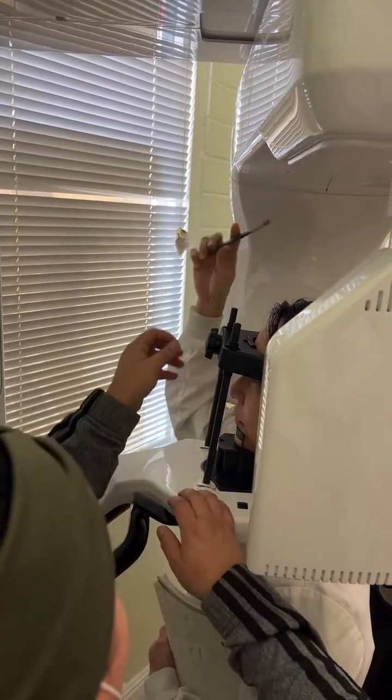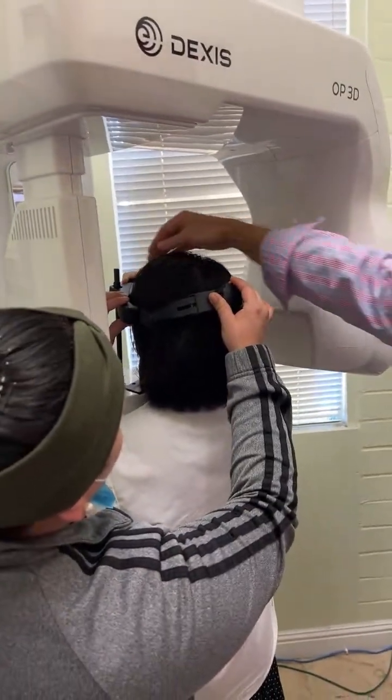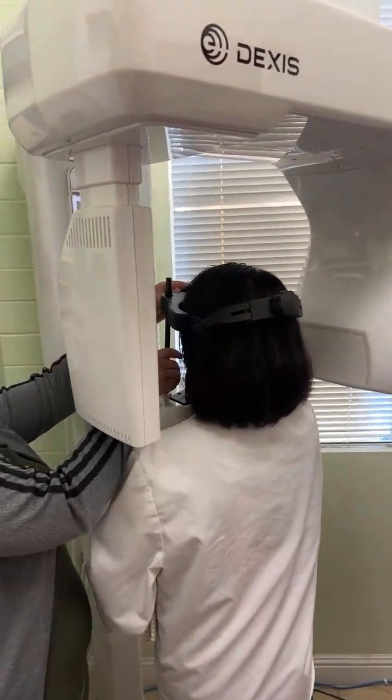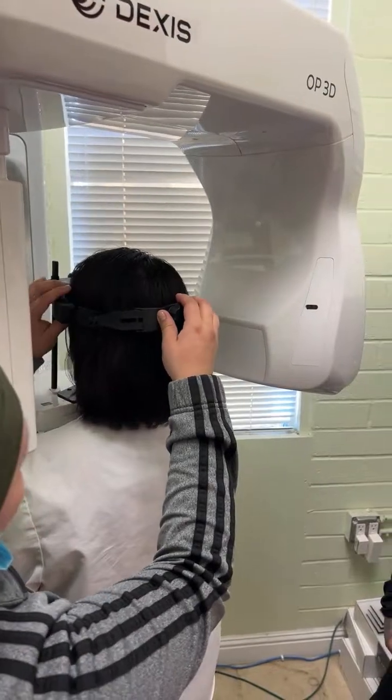Lock it, and then the back. I mean the temple. The temple right here. Right here in the temple front. There you go. And then the back. Yep. And now you can ratchet that.